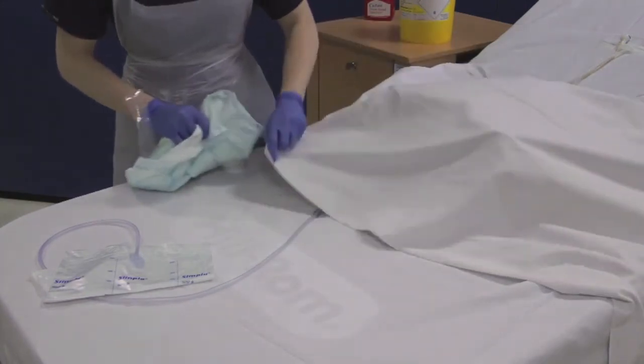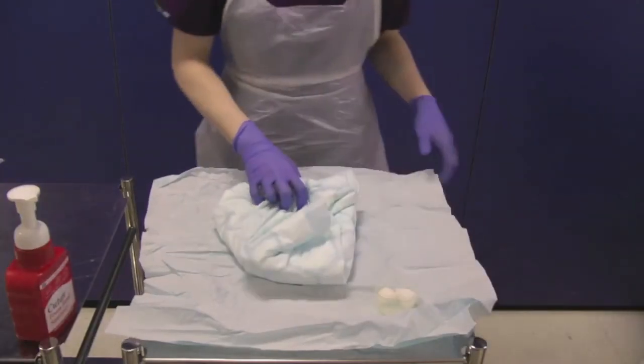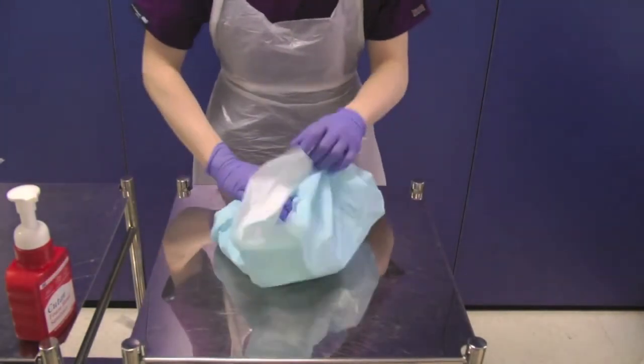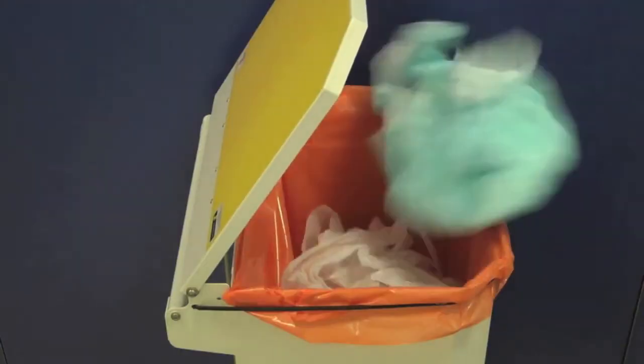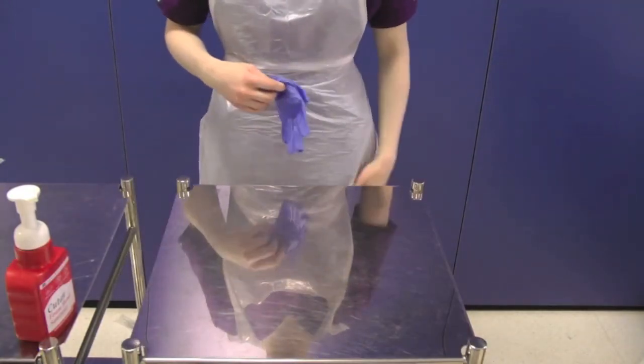Cover up the patient and return to your trolley. Wrap up and dispose of any remaining clinical waste. Remove your gloves and apron and decontaminate your hands.